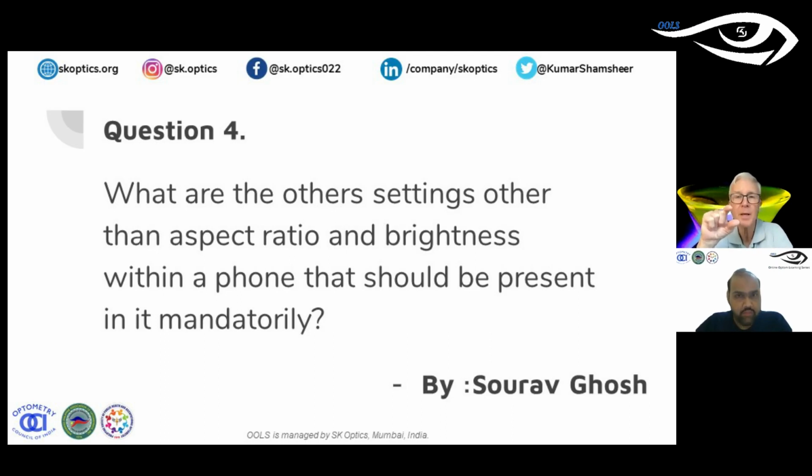Next to that little box, there's a little slider, and that is an exposure setting. And I think if you tap it, it fixes the focal length or the focus of the lens. So that's built into an iPhone. You want to zero in on where you want to focus, and fix the focus there. So that's how you do that.